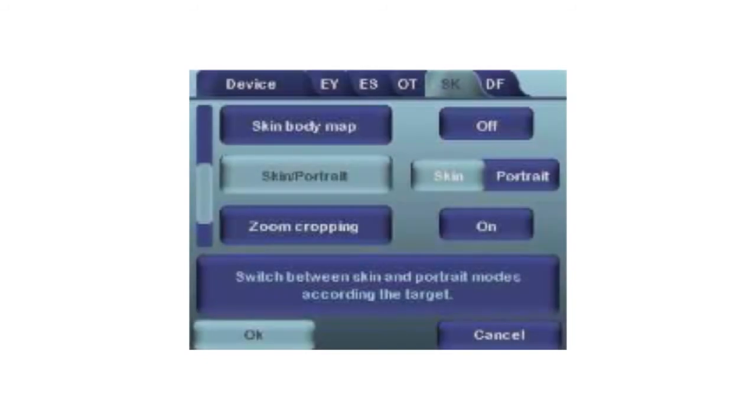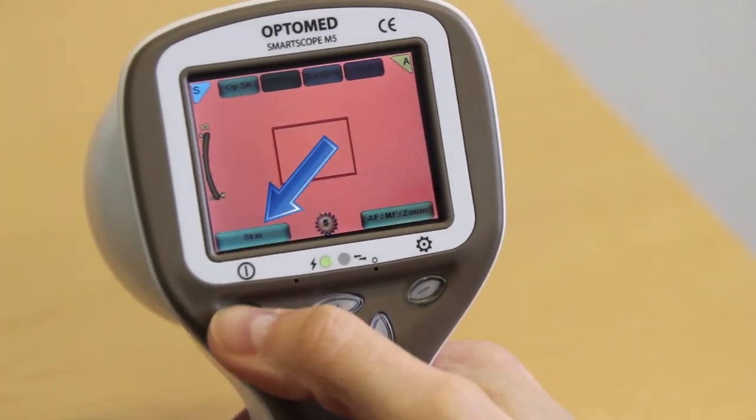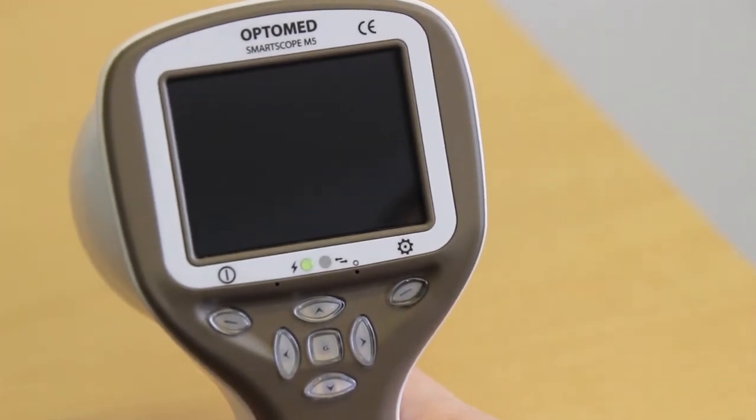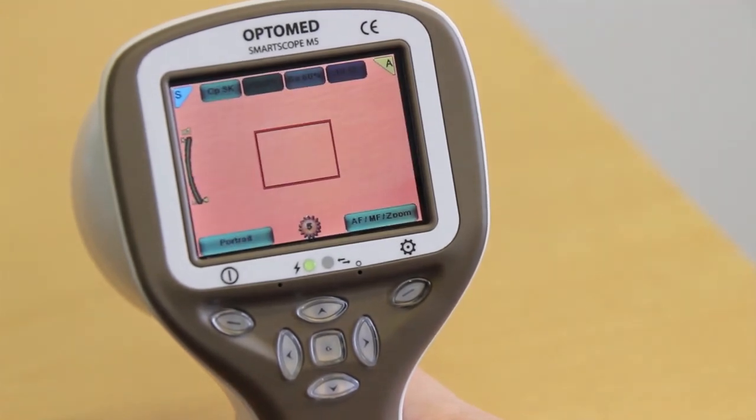Skin or portrait: the skin/portrait feature allows you to take images from close up and from a distance. In skin mode, the camera will focus very close and the module will need to be pressed to the skin. In portrait mode, the camera will focus further away and allow you to take images of the face or any large section of skin. Change between skin and portrait mode by using the left soft key. The icon on the screen indicates the selected mode. The selection can also be made in the SK menu.